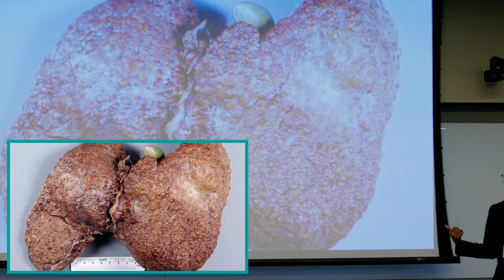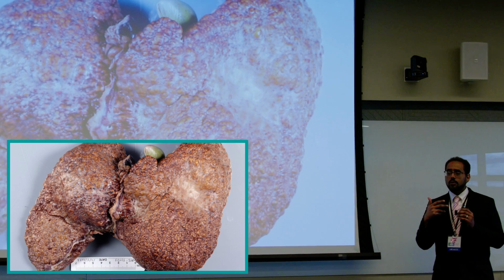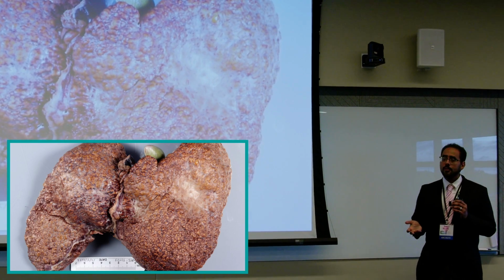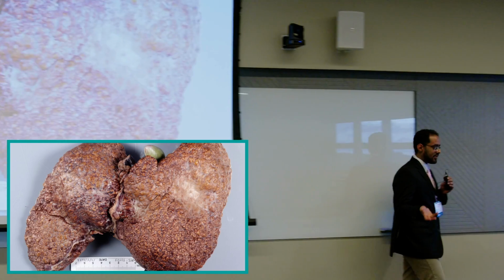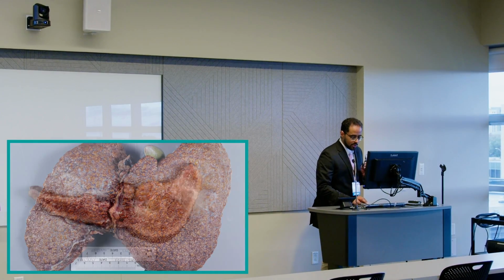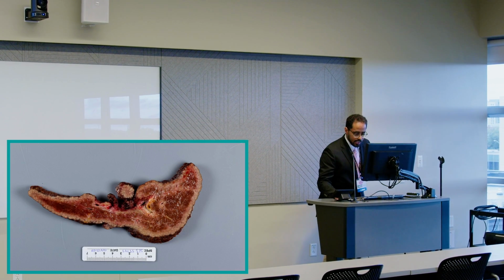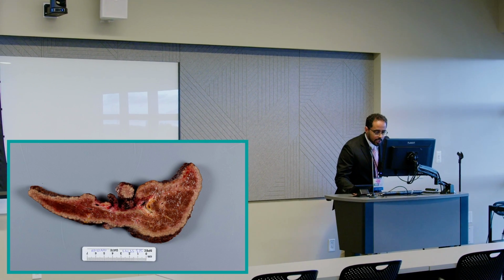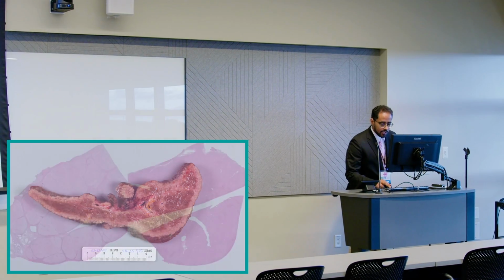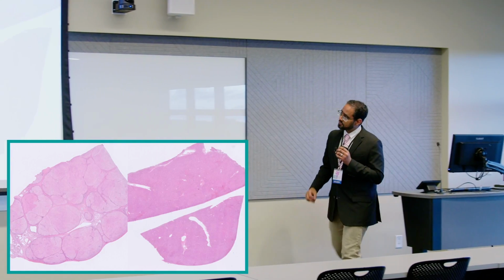And at this time, we cannot tell if it was autoimmune or something else from a pathology point of view. When we look at it, it all looks the same. It looks cirrhotic, nodular, that's the end stage of the liver. To me, it looks better under the microscope. Let me show you. This is a cut section, and all these small round brown nodules are the cirrhosis, but this is under the microscope.